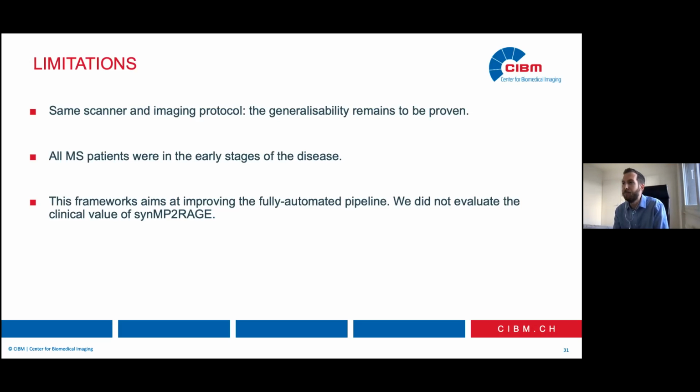So we did not prove the generalizability of our GAN. Secondly, all MS patients considered were in the early stages of the disease and therefore had quite a low lesion burden. Therefore, more patients would be needed to validate it in, let's say, a larger and more diverse cohort. And finally, this framework really aims at improving the fully automated pipeline.